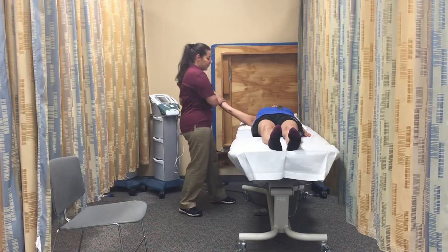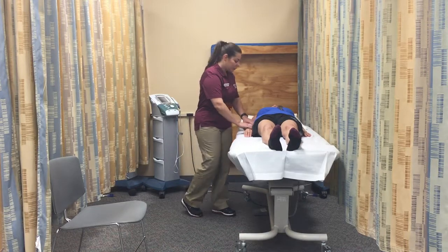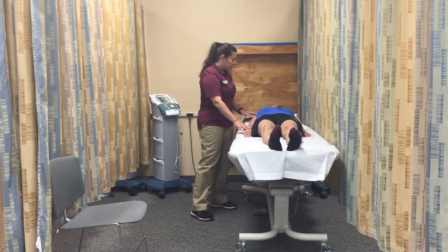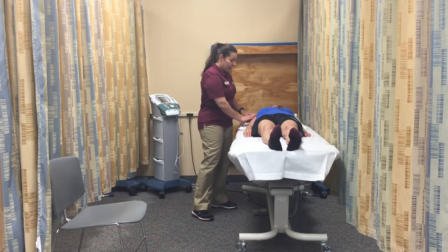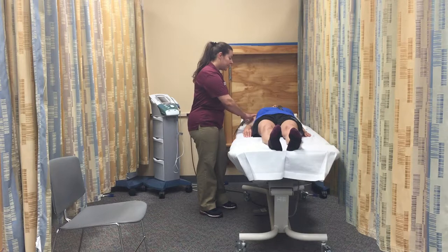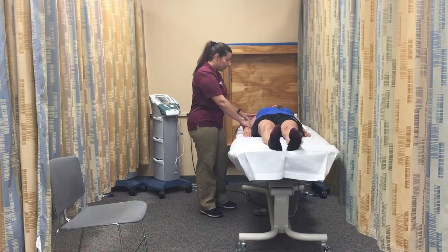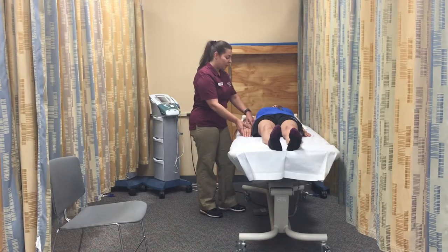I'm going to return the patient to the starting position. I'm going to palpate the anatomical landmark, which is going to be the anterior aspect of the acromion process, where my fulcrum is going to go. The proximal arm is going to be parallel to the midline of the anterior aspect of the sternum, and the distal arm is going to be the anterior midline of the humerus.